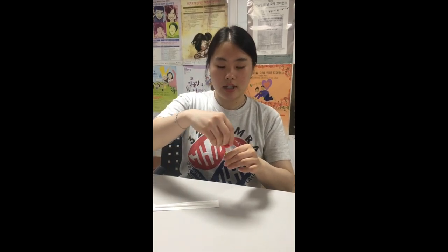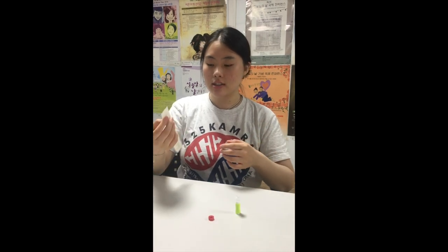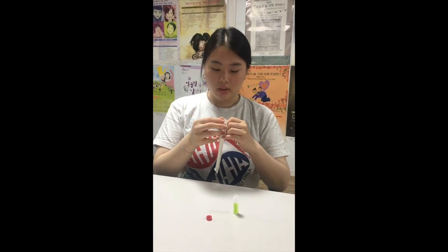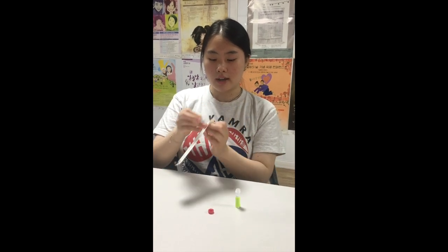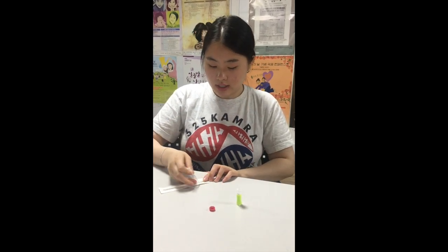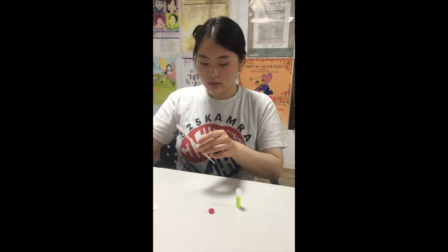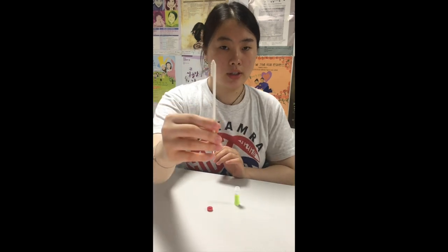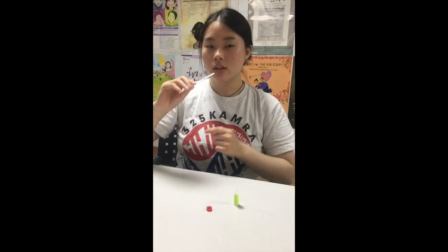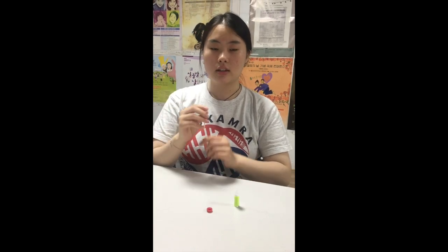For the testing part, you can go ahead and uncap the container lid so that it's easier for you after you've done testing. Make sure you peel the packaging all the way to the end so you don't damage the cotton part of the swab. Hold it by the middle, and make sure the cotton part touches the inside of your cheek and that you scrape for at least 30 seconds, like so.